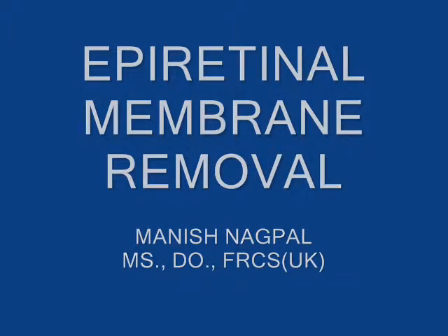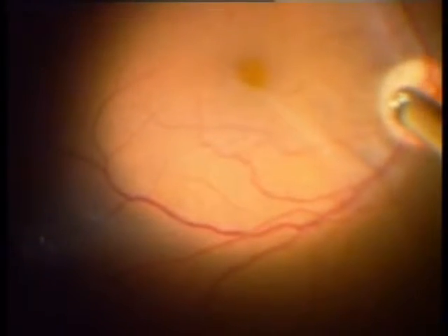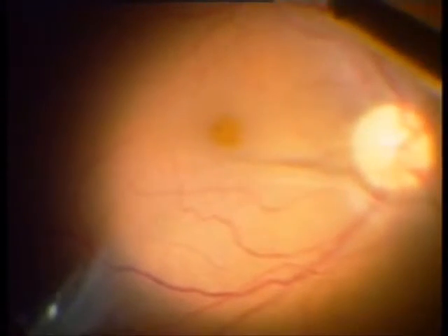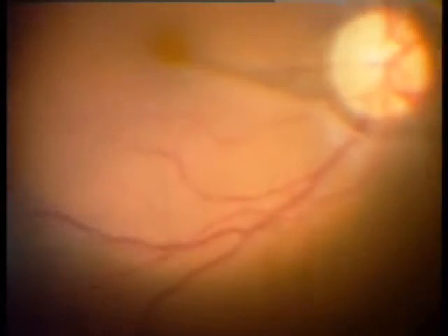Epiretinal membrane removal. After a core vitrectomy, the posterior hyaloid is peeled off using high suction with the cutter.